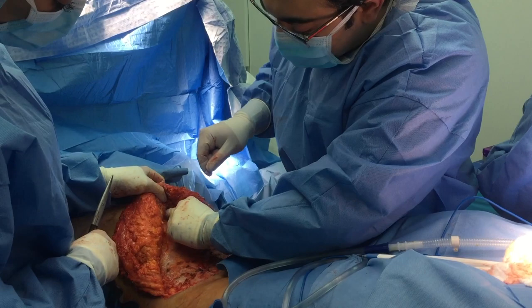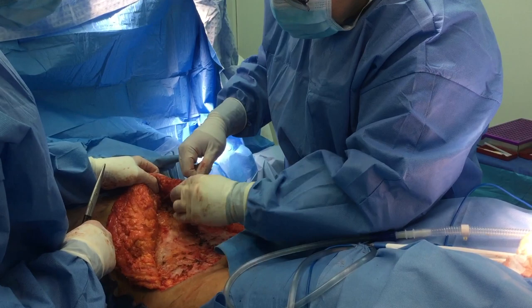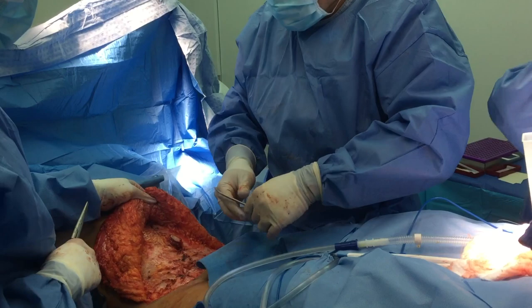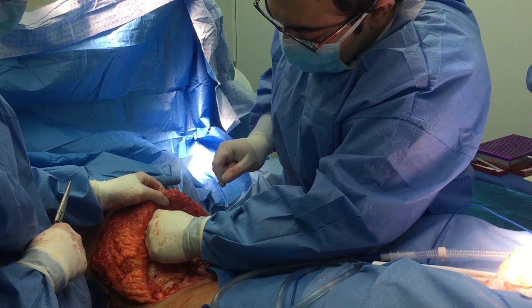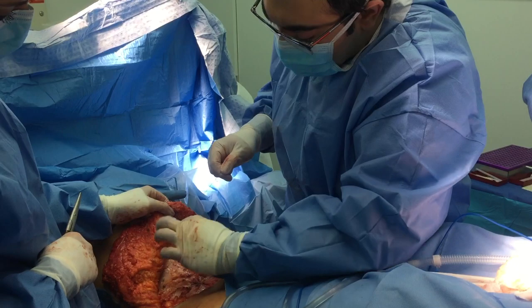You can see we have a narrow central tunnel, and then we're widely undermined a little bit out here inferiorly. What I'm doing is placing the first three and basically tagging them as I go along. We are using a 2-0 Vicryl on a GS21. Go ahead and advance that flap for me — good. That way there's no tension and I can basically feel my sutures being placed down and securing the flap.